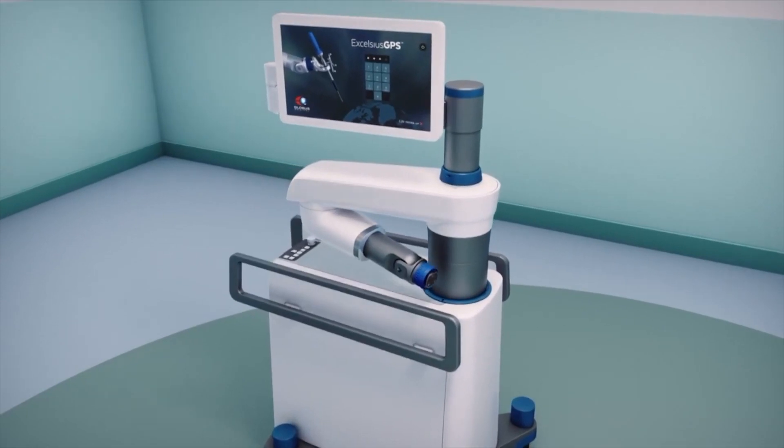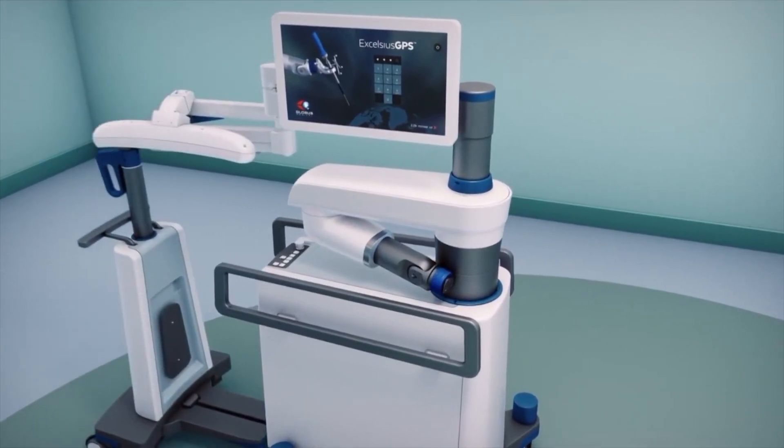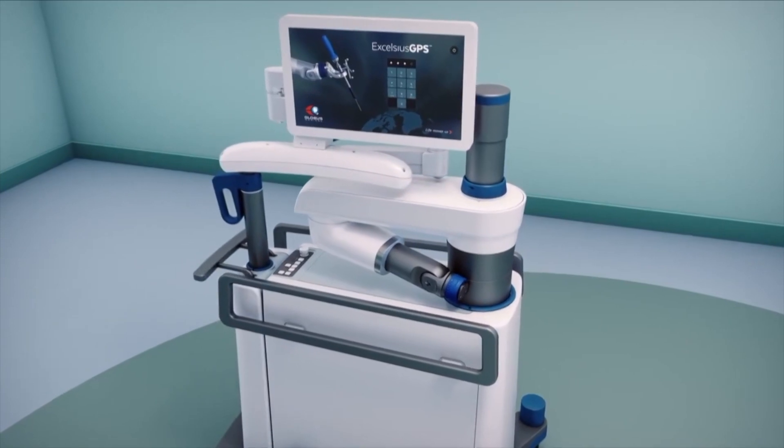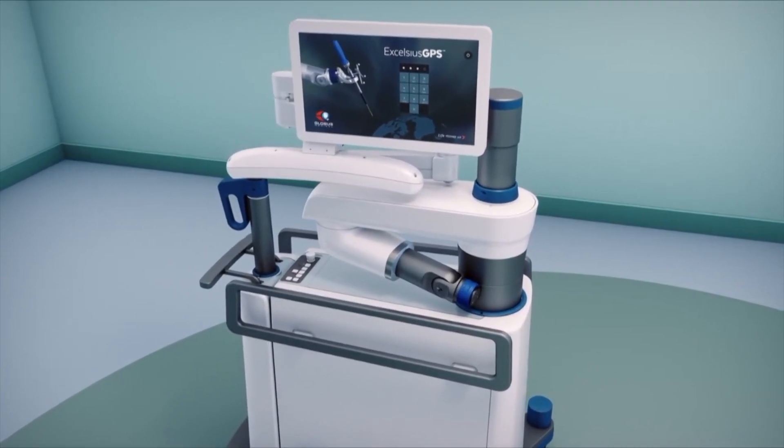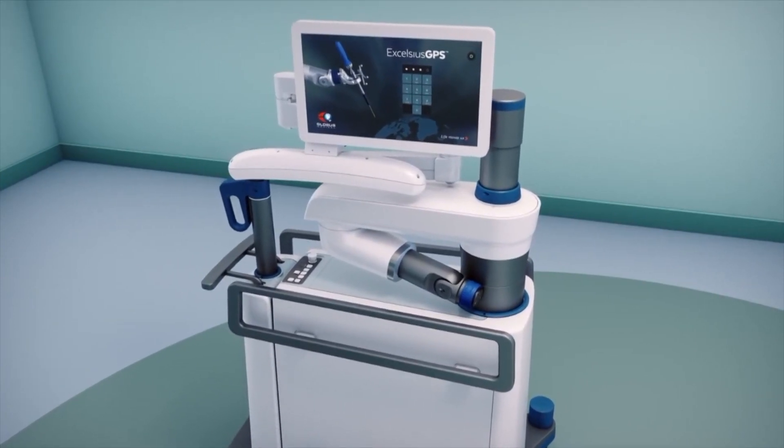Robotic spine surgery offers safety, precision, less pain, small scar, faster recovery, and reduced hospital stay to the patients.